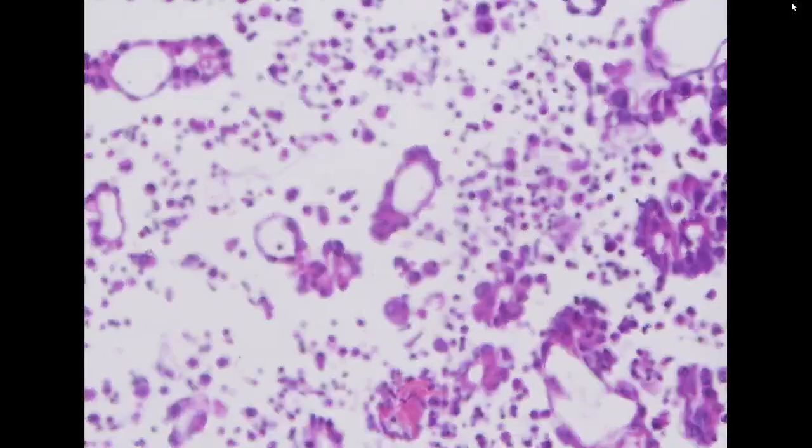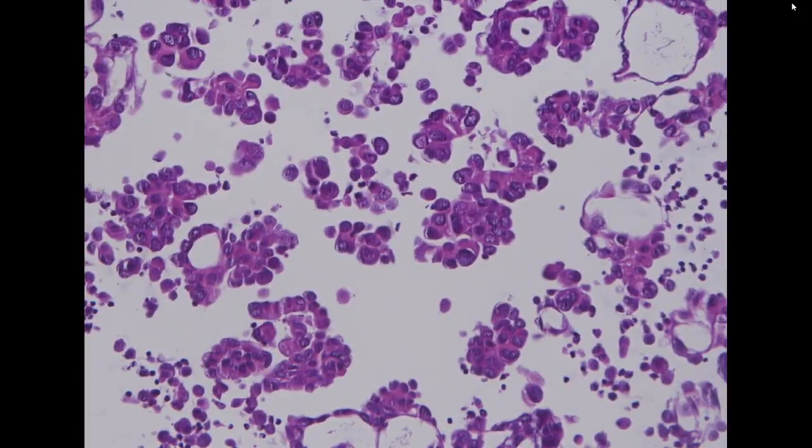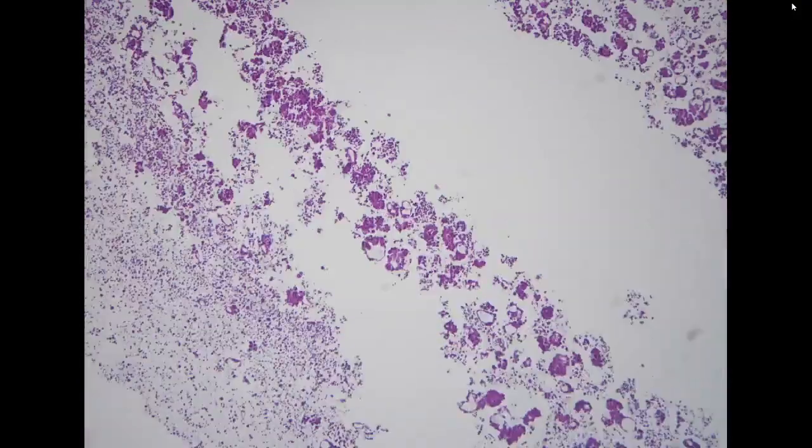So this is positive for adenocarcinoma. If it's positive for TTF1, the clinician will proceed to order EGFR testing on this pleural effusion specimen. We have plenty of cells for the examination.